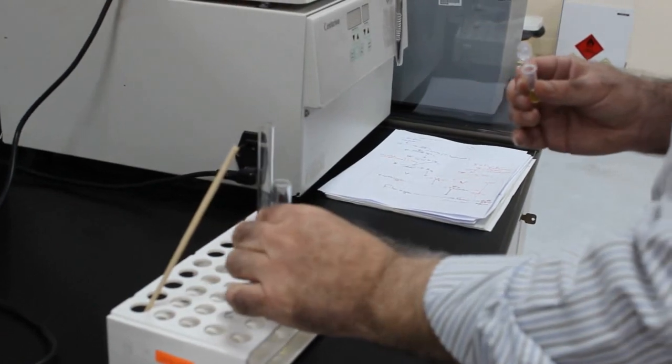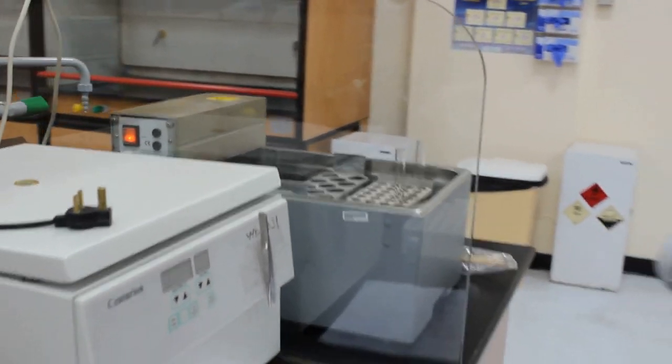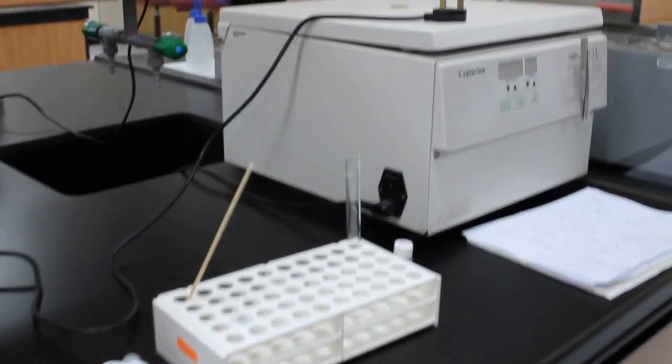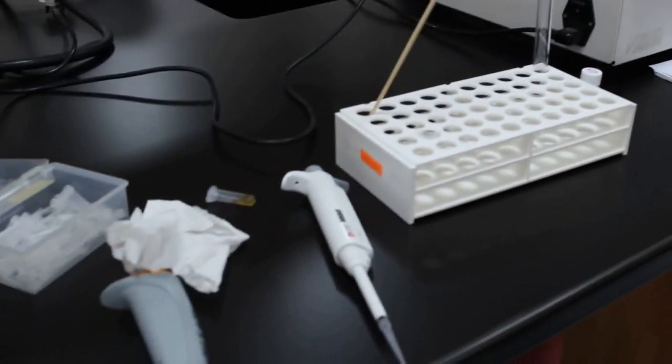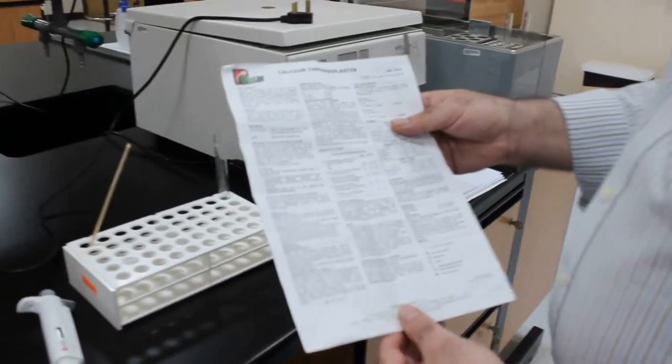Put the plasma in a water bath for 2 minutes at 37 degrees, according to the insert of the kit.